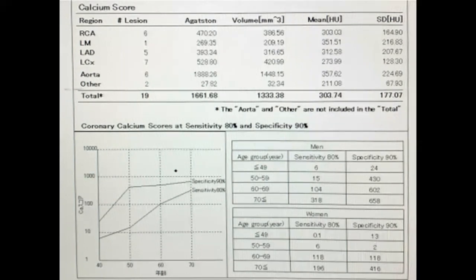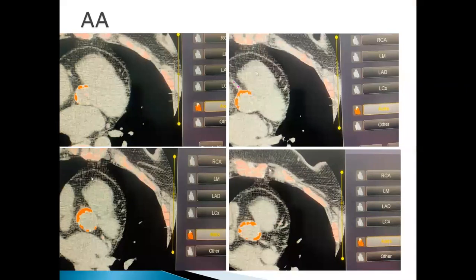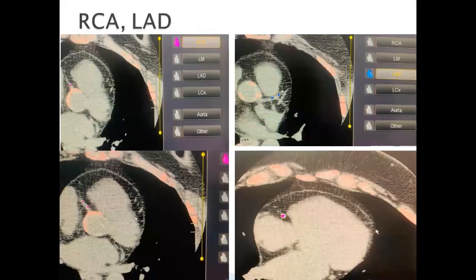So if you can see, when you just look even at these two images, this is why I was insisting on anatomy. If you see my pointer, this vessel here that is branching, if you don't know that it's the RCA and you click it as the left main, or if it's the LAD, you click it as the left circumflex artery.